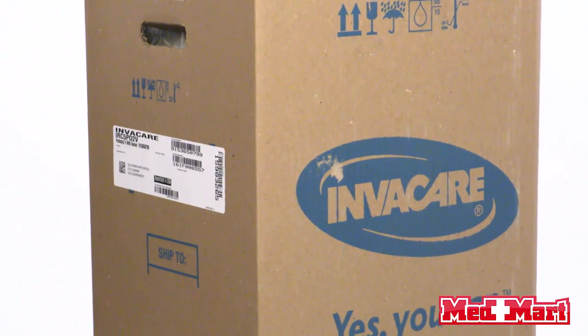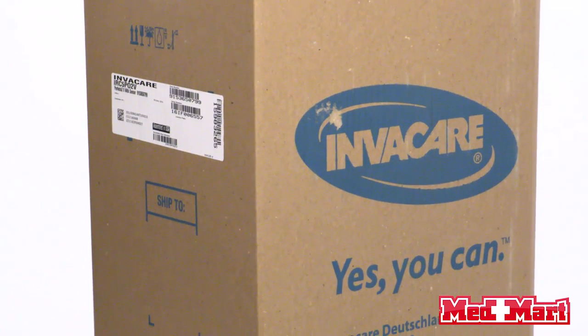Today we're going to talk about the Invacare Perfecto 2 concentrator. It's going to come packaged at a weight of 45 pounds, and then the inside concentrator is going to be about 43 pounds.